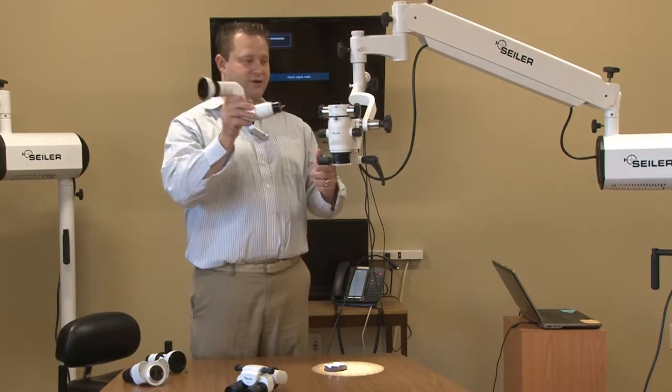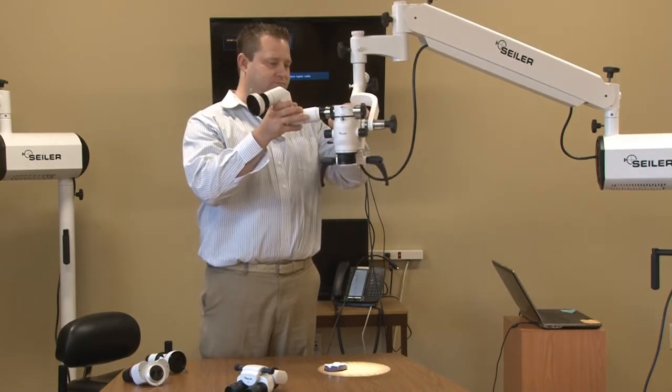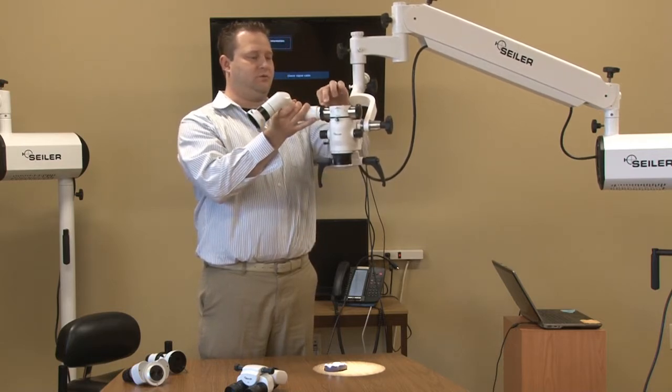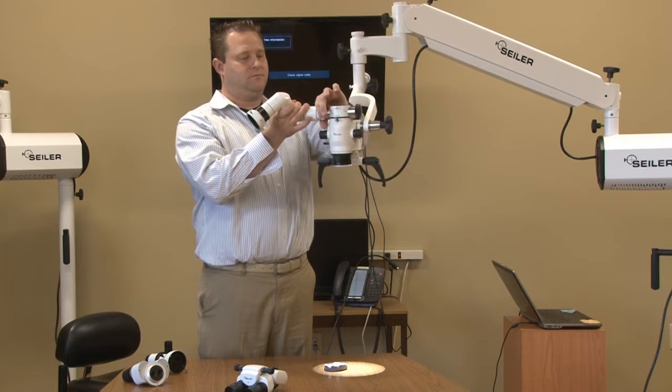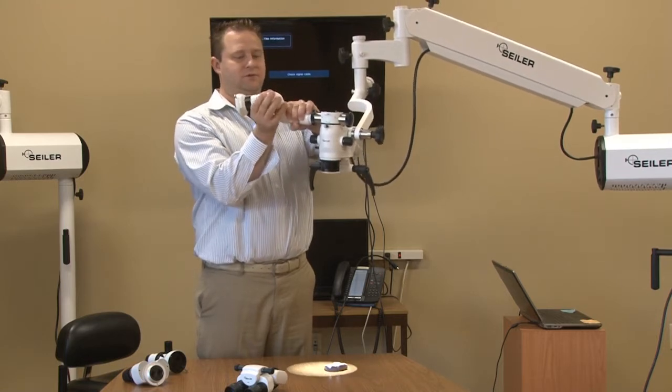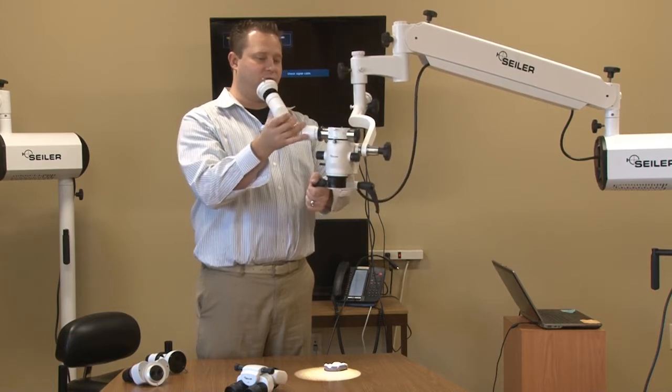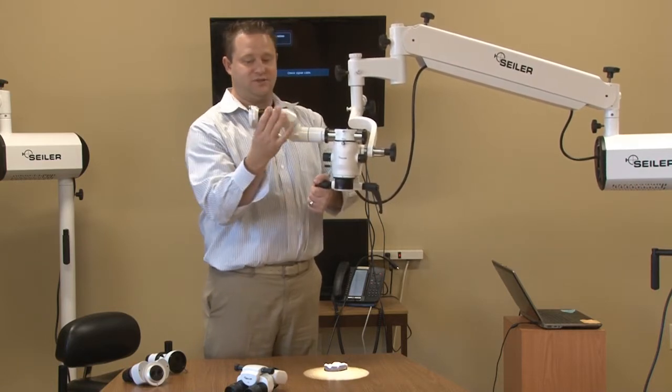We're going to take our 3D coupler and rotate it in there. The nice thing about the coupler is we can rotate this now in any position we want.